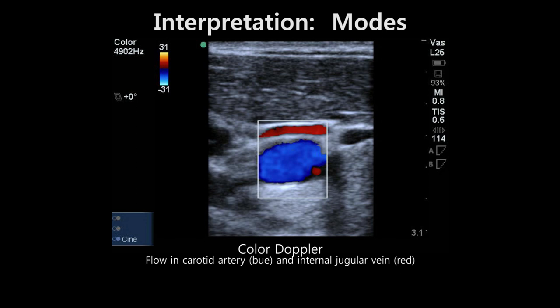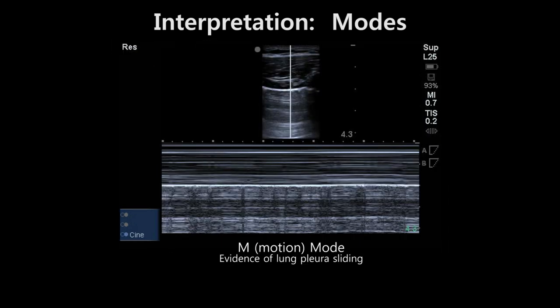Color Doppler depicts velocity and direction of flow on a color map of a 2D image. Blue indicates flow directed into the screen; red indicates flow directed out of the screen. Remember that these colors do not correspond with arterial or venous flow. M-mode plots a single scan line of a 2D image over time, allowing the user to further characterize the motion of structures along the line of interrogation — useful, for example, when assessing pleural sliding. A full explanation of these modes is beyond the scope of this lecture.